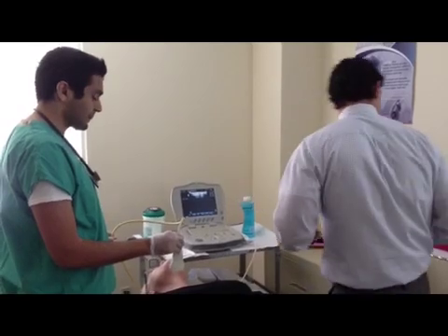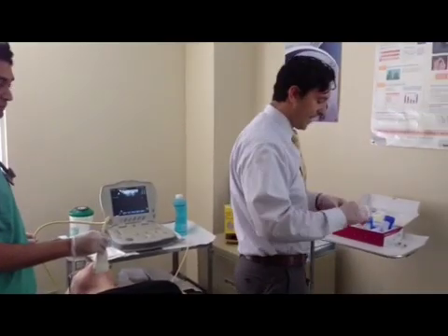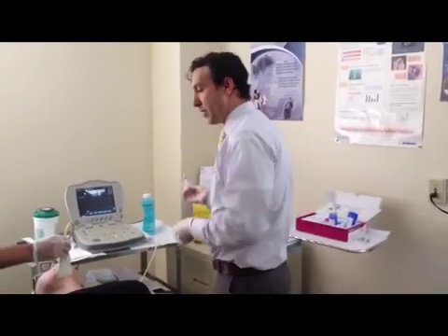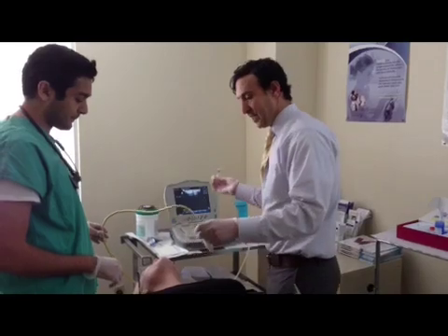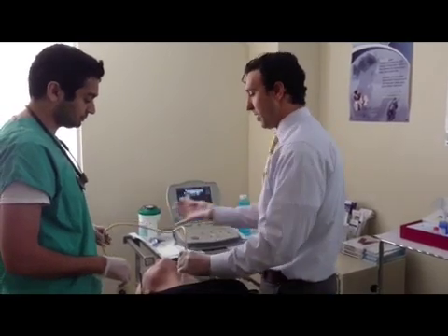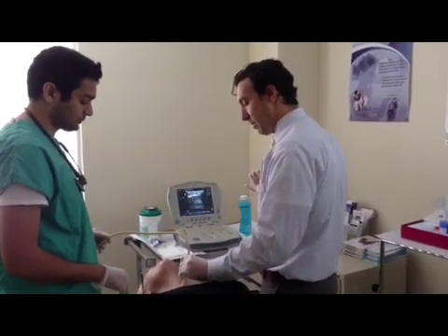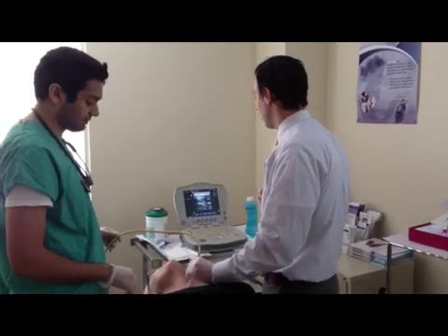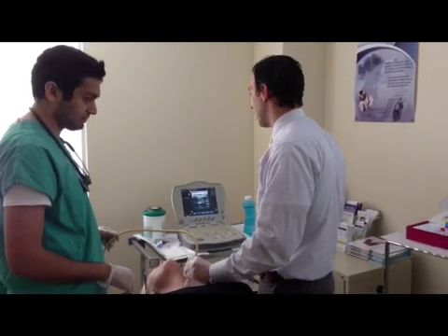As you can see, we're going to be doing this under ultrasound guidance. What we have here is a 27 gauge needle — it's a very thin needle, much smaller than what you would use going to a lab to get blood drawn. Those needles are typically 22 gauge or 23 gauge needles.